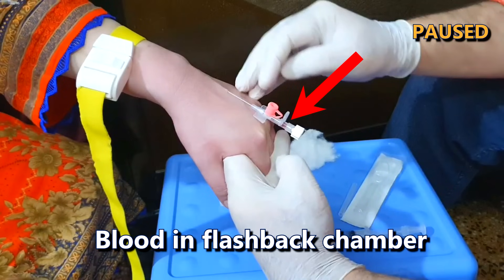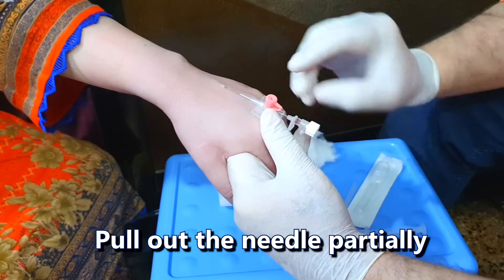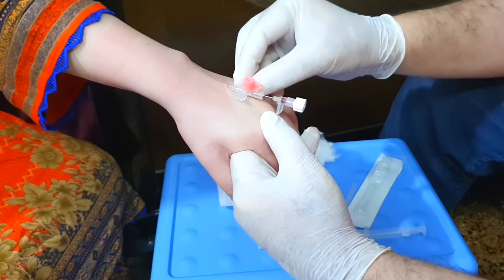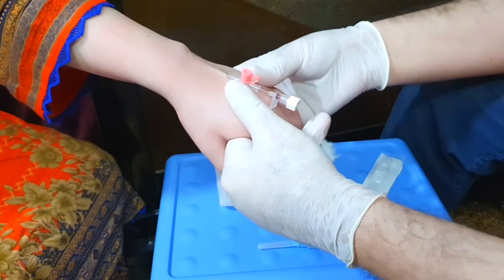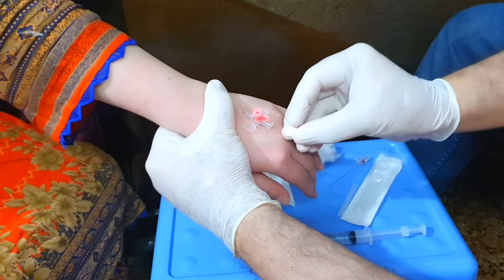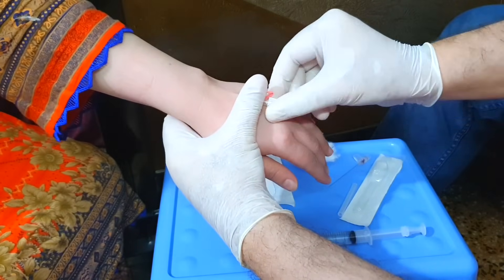You will be able to see blood in the flashback chamber. Open the tourniquet now. Pull out the inside needle by a few centimeters and move the cannula forward so that it goes all the way into the vein. Once the cannula is inside the vein, apply pressure on the tip of the inserted cannula and completely pull out the needle. Close the cannula by using the plug — pressure applied on the tip of the cannula will prevent any backflow of blood.